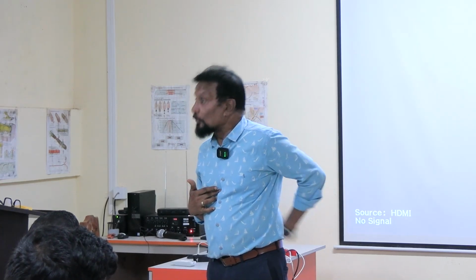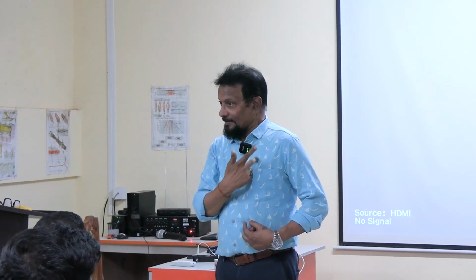V4 is in the 5th intercostal space. The 5th intercostal space starts from here and goes to the back up to the vertebral column. Where to keep it? At the mid clavicular line. So draw a mid clavicular line, a vertical line, and it will cross the 5th intercostal space.